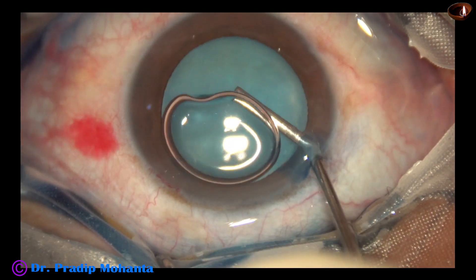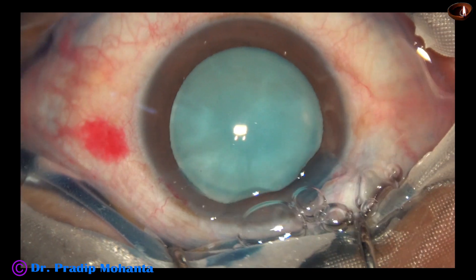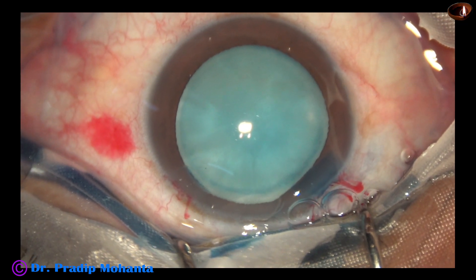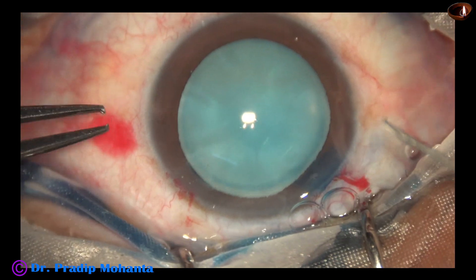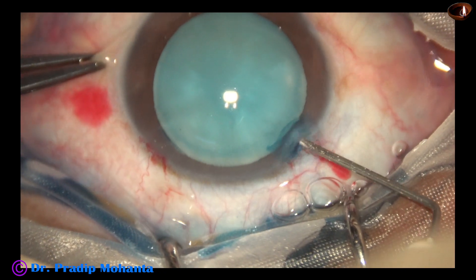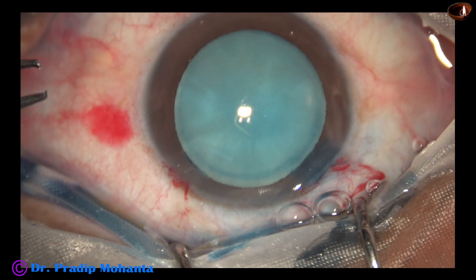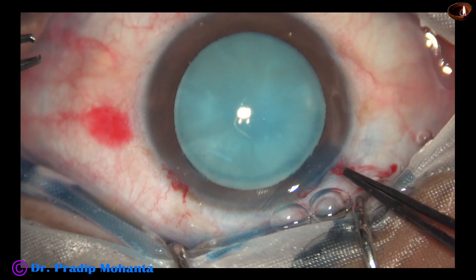Visibility becomes better. The anterior chamber is then filled up with 2% hydroxypropylmethylcellulose. A 26-gauge bent needle cystitome is used to make a C-flap.